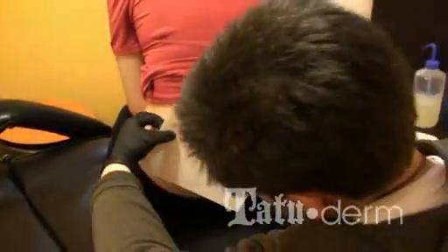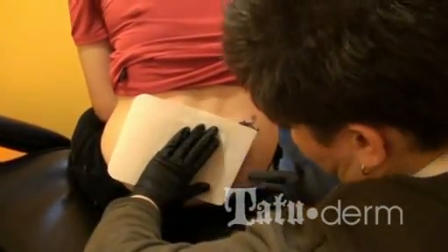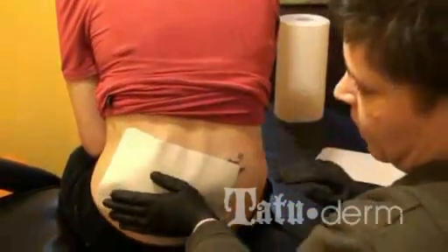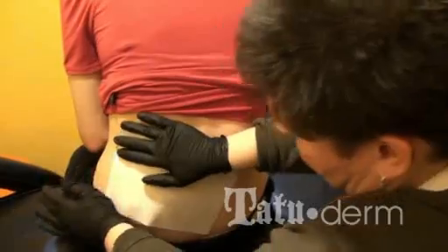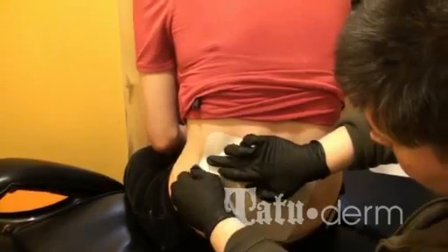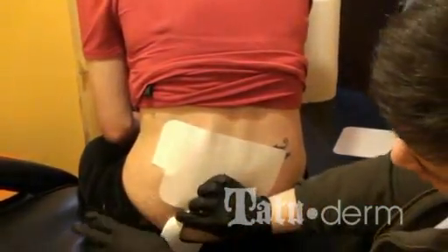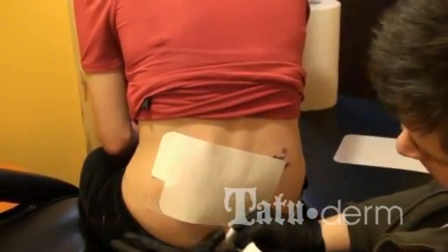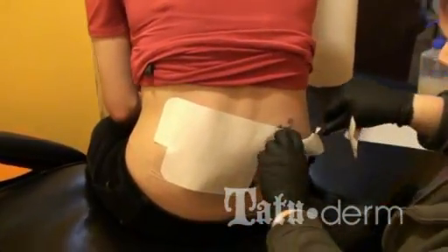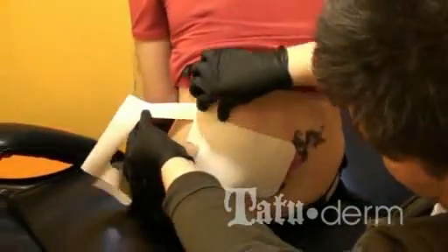Apply your sheets just like wallpaper and give a little rub with your hand to let the tape stick. The warmth of your hand and their skin will make it adhere. Then grab the split, hold it down with your opposite hand, and pull away directly against the tape. It creates a suction between the skin and the tape, which keeps your adhesion really good and makes a good seal.